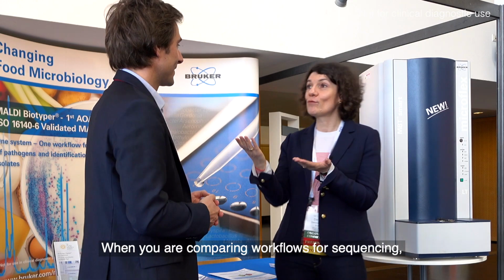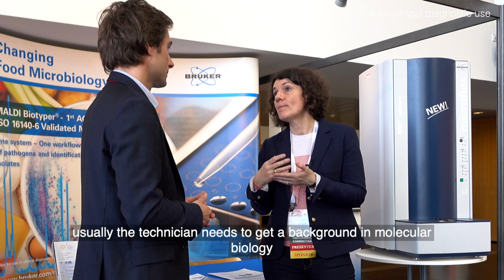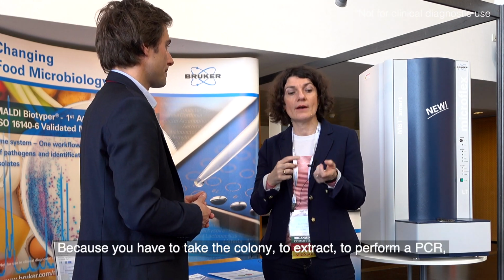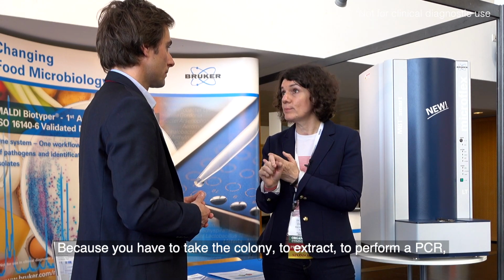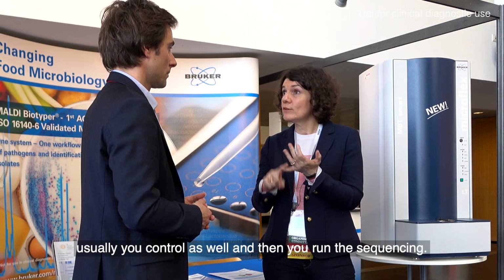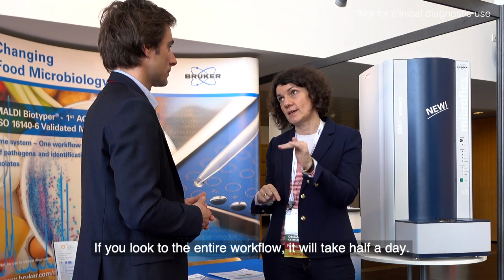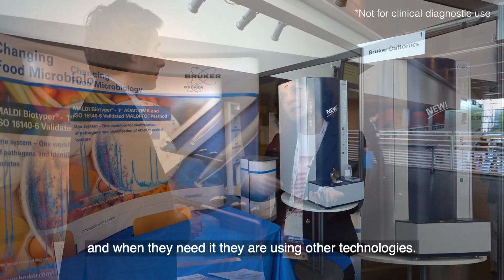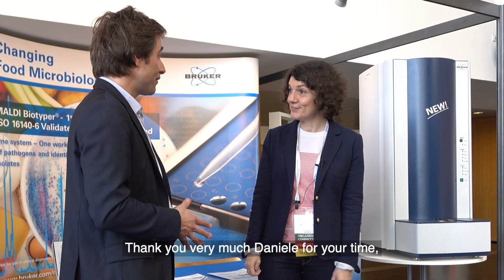When you are comparing the workflow for sequencing, usually the technician needs to have a real background in molecular biology, and the workflow is not so easy because you have to take the colony to extract. This is the step to get a PCR, and usually you control as well, and then you run the sequencing. If you look at the entire workflow, it will take half a day. In most cases they use the MALDI Biotyper for fast screening, and when they need to, they use other technologies. So thank you very much, Danielle, for your time.